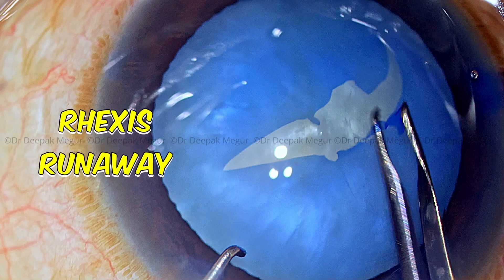Contrary to this case, there is another case which is again an intumescent lens and we don't find any areas of liquefied cortex here. Compared to the previous case where we could see those isolated pockets, we don't find anything — everything is diffusely opaque and diffusely swollen, so the cortical fibers themselves are swollen with no liquefied cortex. The chamber is very well filled with dispersive OVD to ensure adequate pressurization and no loss of the anterior chamber. I have punctured the capsule with the forceps itself and I'm just trying to grasp it and use the tearing technique — but by that time the other end is running away.